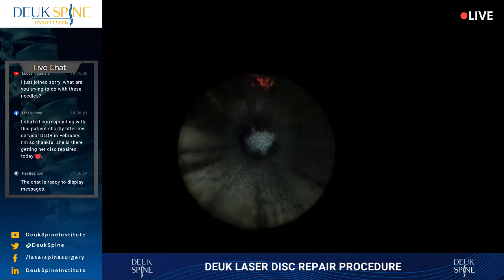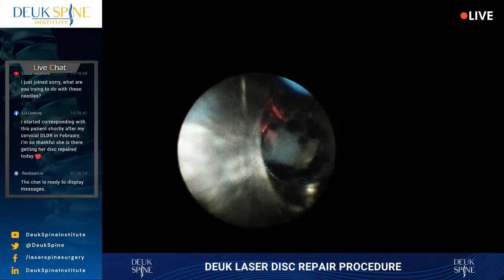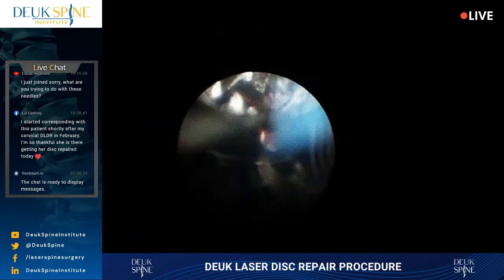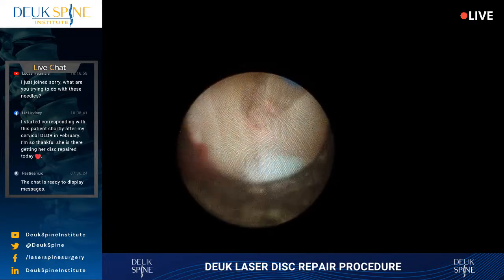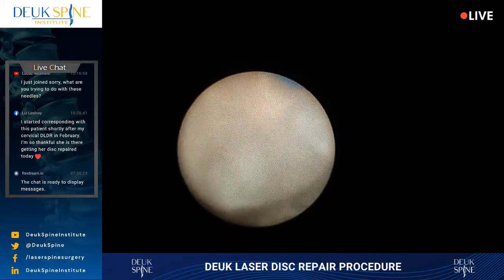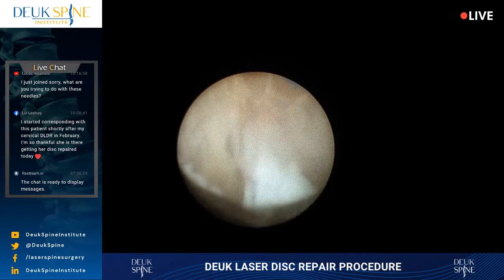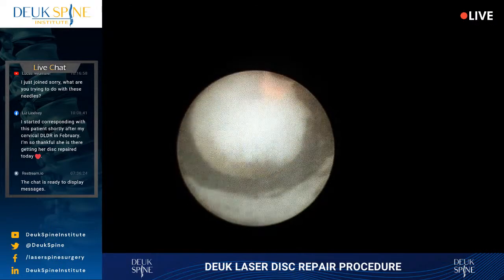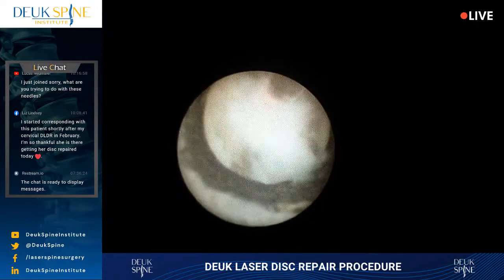You won't be able to separate the esophagus and the carotid sheath, or the trachea and the carotid sheath. And it's very important that you work between the trachea, esophagus, and the carotid sheath. Does that make sense? So you really do have to have what's called a plane of separation. And that plane of separation is very important.